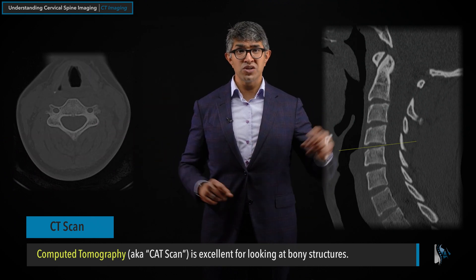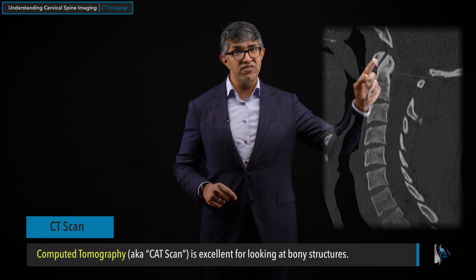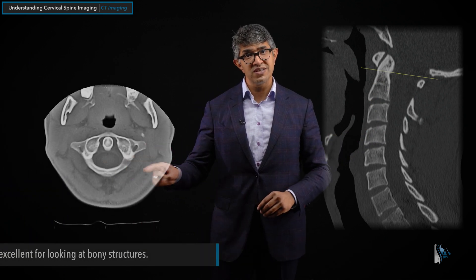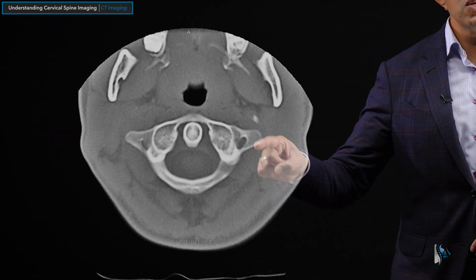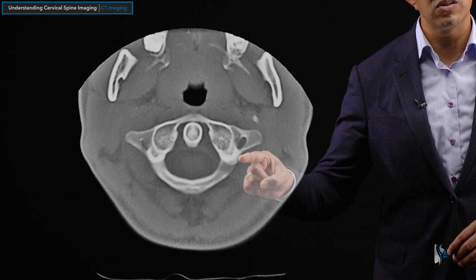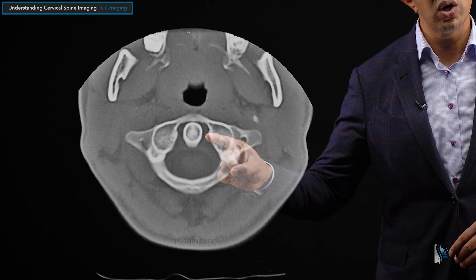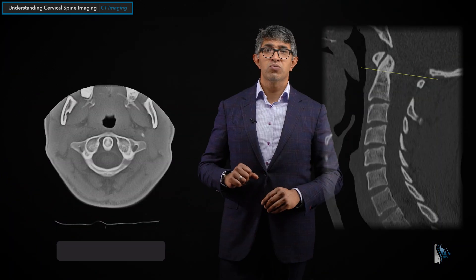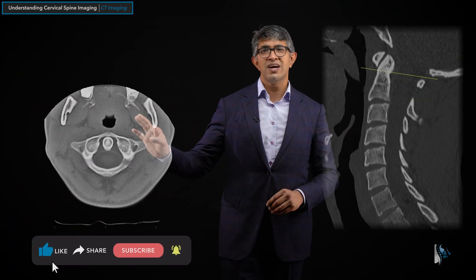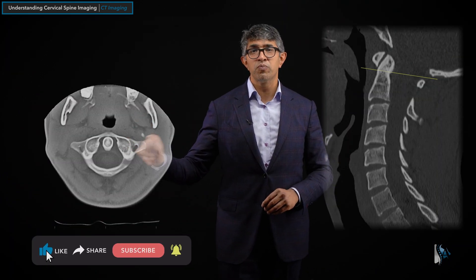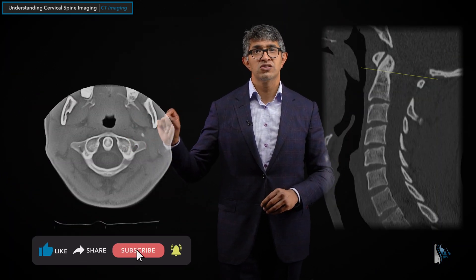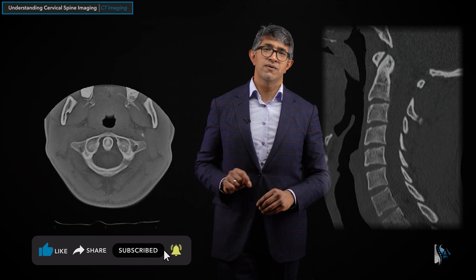These are high-resolution images, and if you take one up very high, you get an image that looks like this. Here's C1-C2, the lateral mass of C1, and what's called the odontoid process of C2. You can get really clear pictures of what the bony architecture itself looks like.